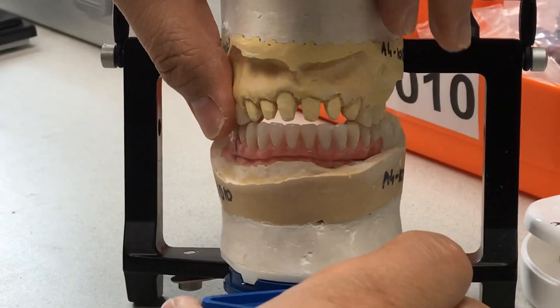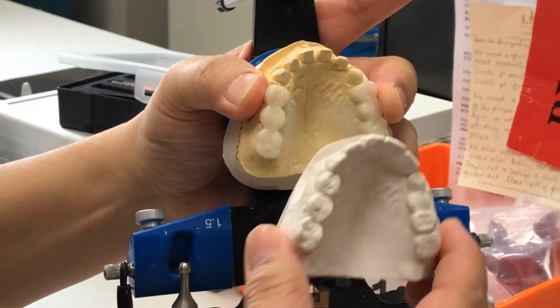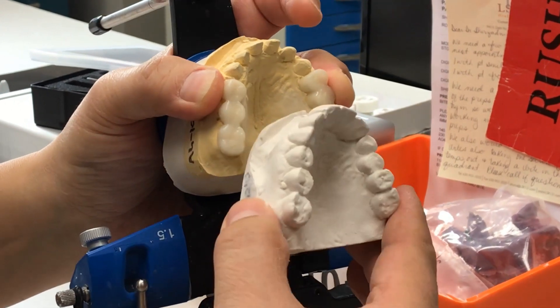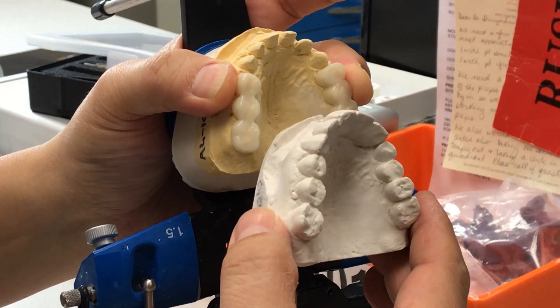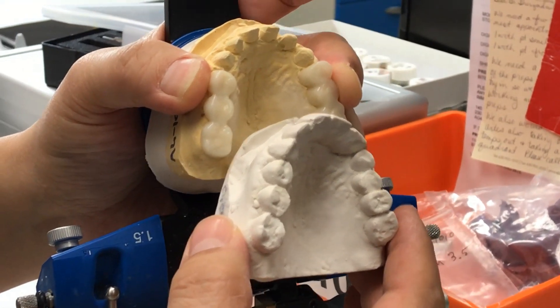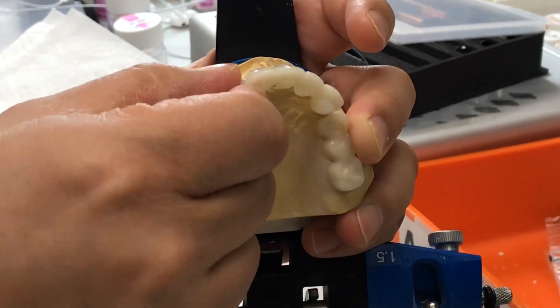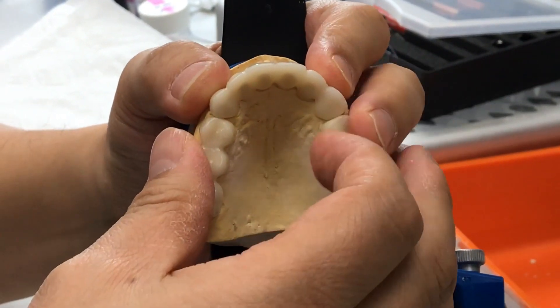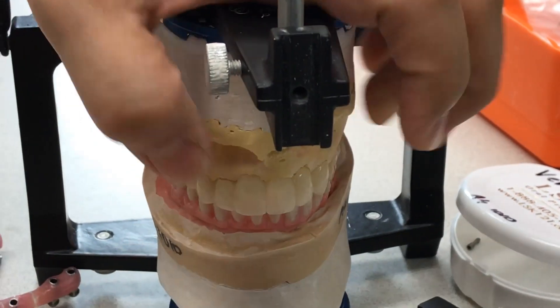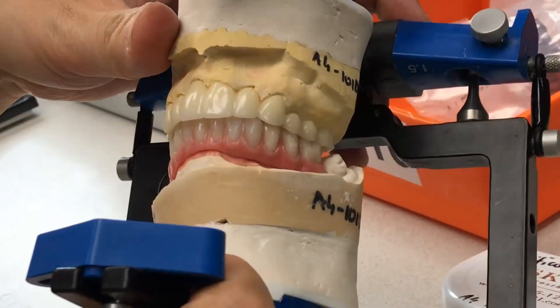I set the teeth after we prepped six teeth, and then we tried to bring in the five-unit bridge as much as possible, trying to get the class one bite. Then with the six-unit, we did the digital temps and finished them up.